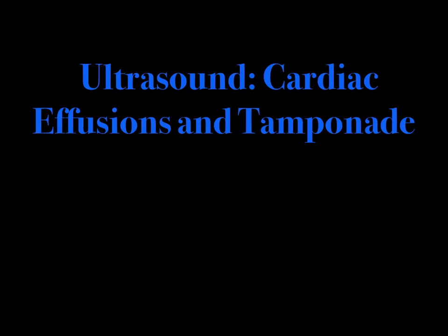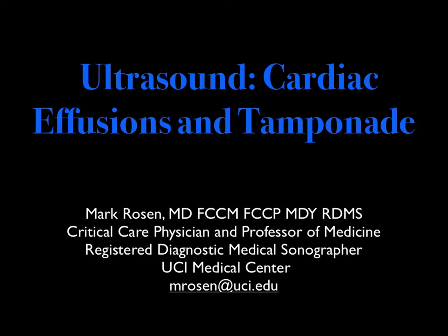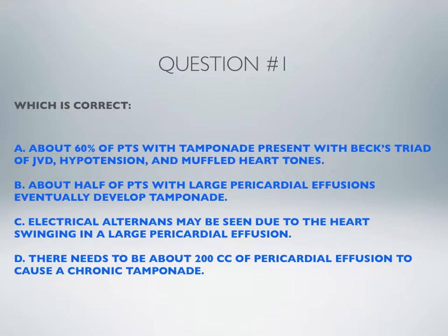Hello, this is Dr. Mark Rosen, and today we're going to be talking about cardiac effusions and tamponade, specifically how it relates to ultrasonography in the intensive care unit and the emergency department.